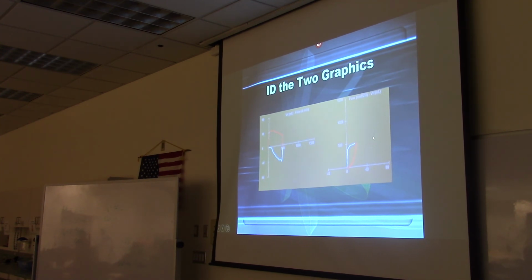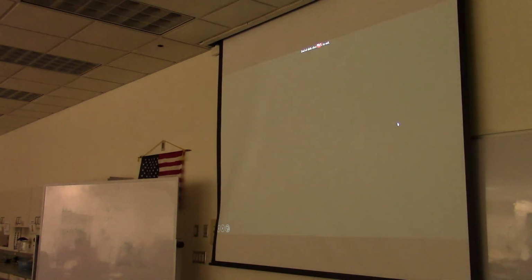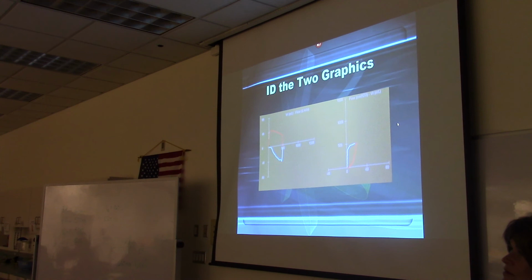All right, what is this called? The hysteresis curve? And what is the maximum pressure that built up in the lung when the volume was delivered? Between 10 and 20. Okay. So about 20 centimeters of water? Yeah. Okay. And what was the volume that went in? 500. Yeah, then you look on the y-axis, about 500 ml. Is the red inspiration and the blue expiration? Yes. Very good. And that ends this presentation.